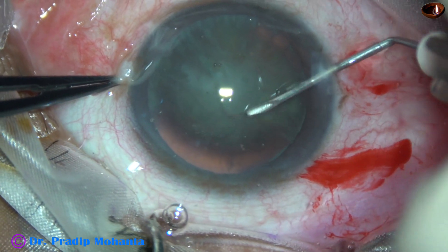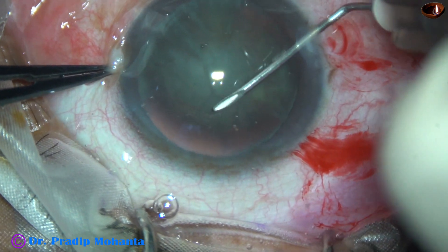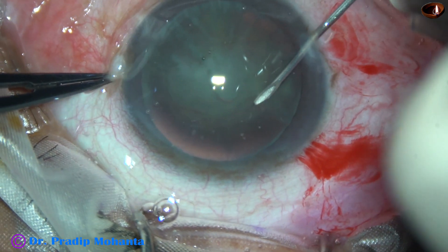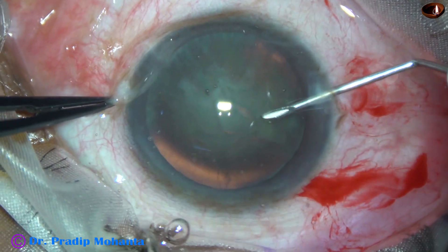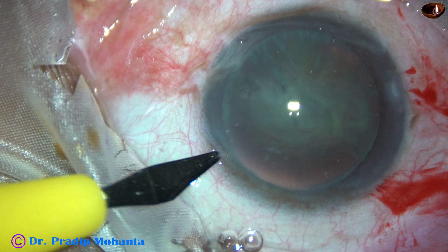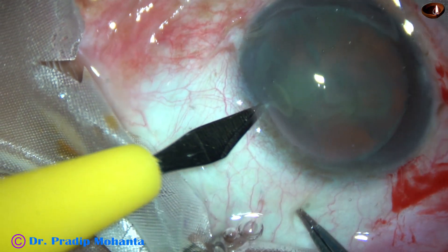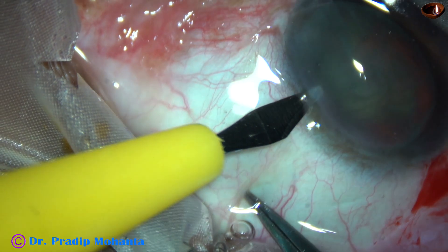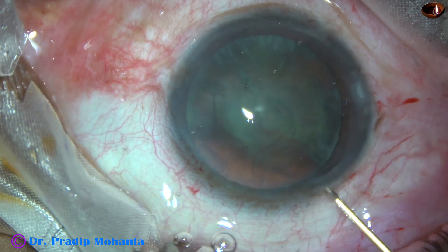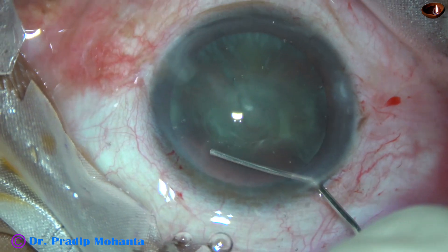In this case, the rhexis became quite small — probably 4.75 mm. Now this is the side port on the left side of the main incision, so we have two side ports and the main wound in this case.